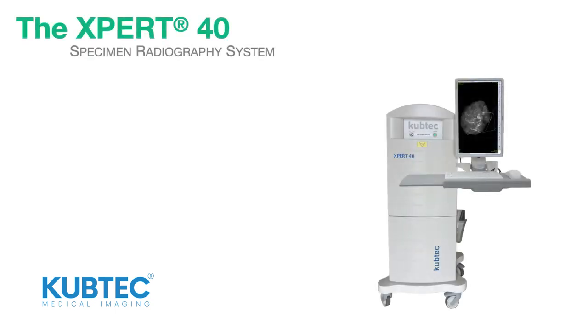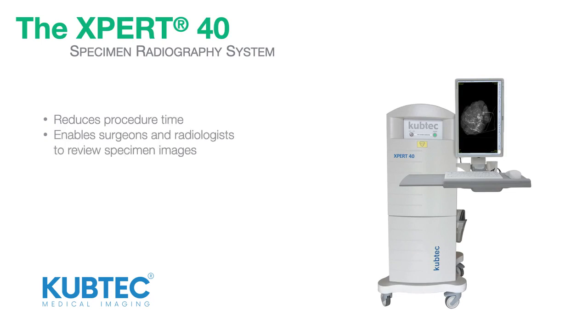The XPERT 40 Specimen Radiography System from Kubtec reduces procedure times by enabling surgeons and radiologists to review specimen images intraoperatively, right there in the OR.